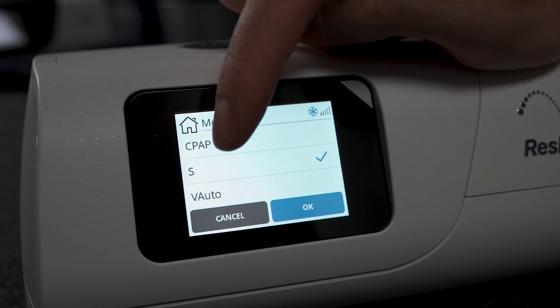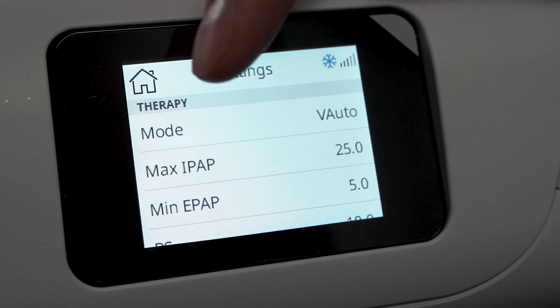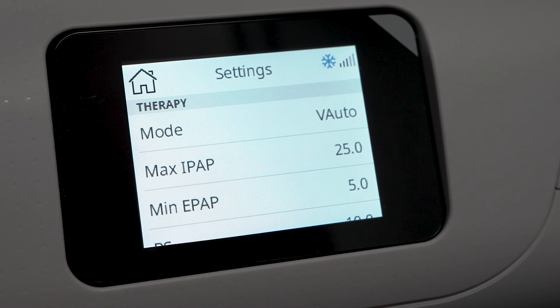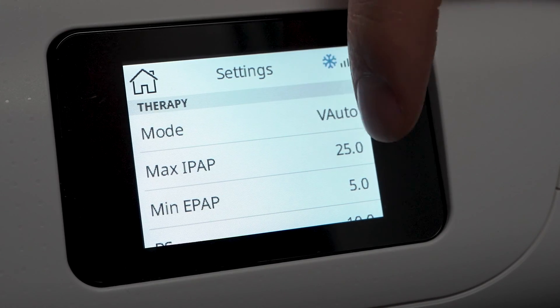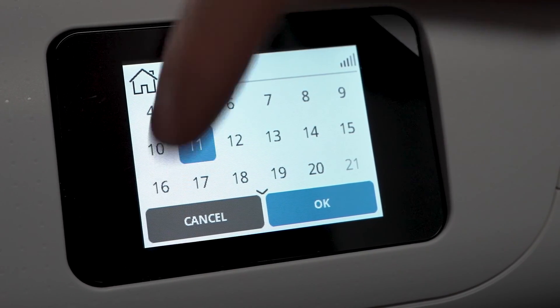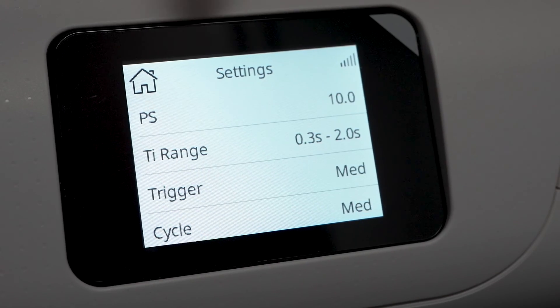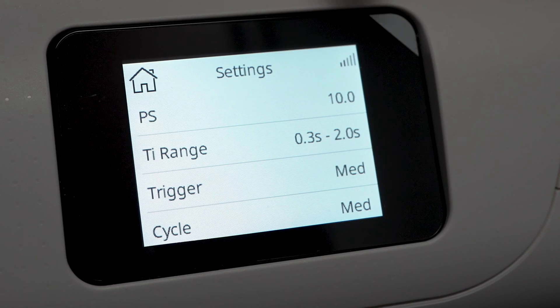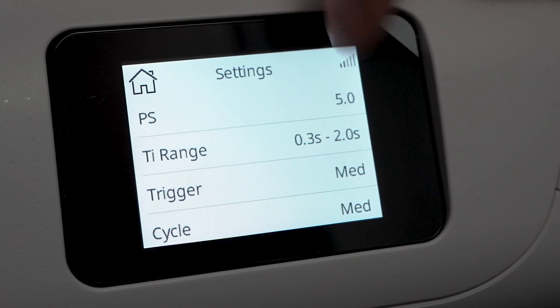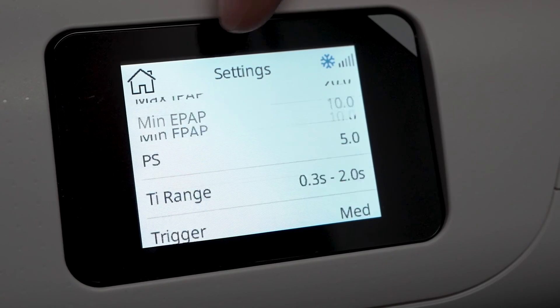Now under mode we're going to click V-Auto. Your max inhalation pressure is 25 and your minimum exhalation pressure is 5, so the machine operates somewhere in that range. We can change these — for example, a max pressure of 20 and a min pressure of 10. We also have PS, or pressure support, which is the difference between the two pressures. For example, we can set PS to 5.